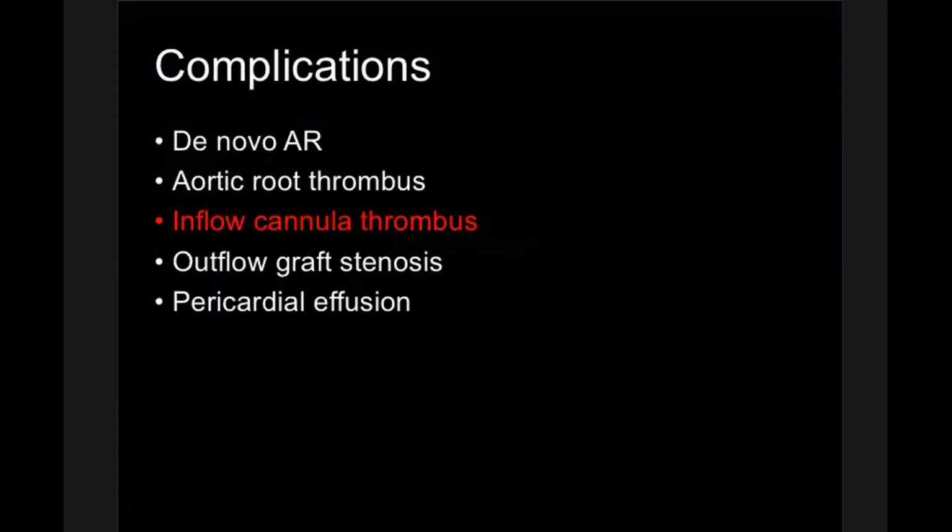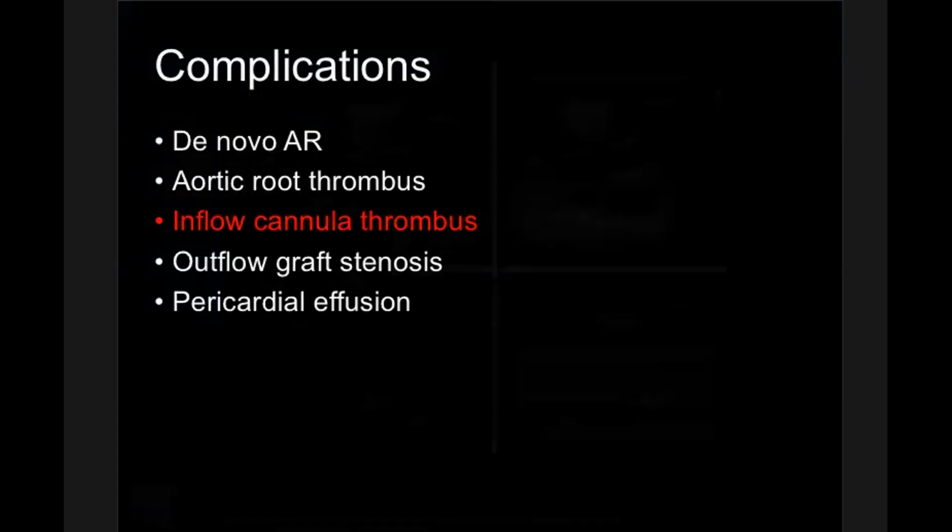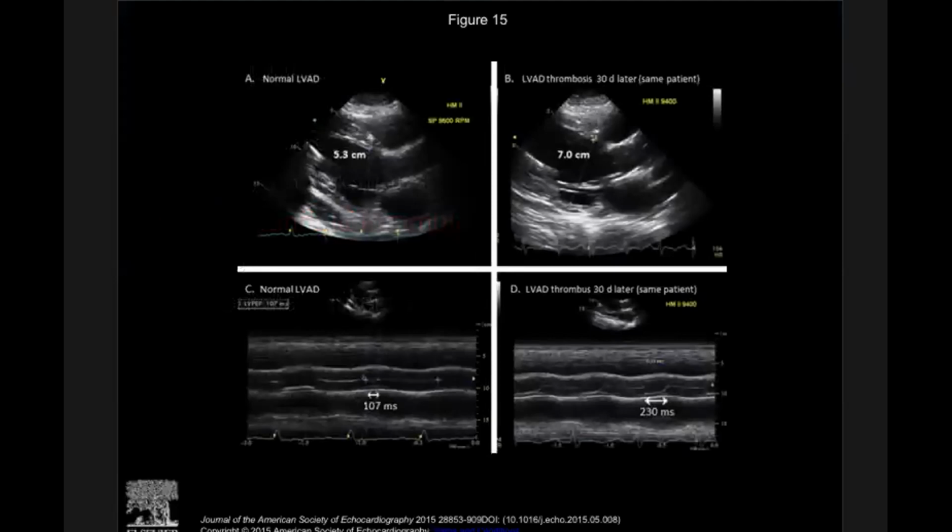Inflow cannula thrombus, I showed us this slide earlier, and that can be noted with the fact that the LV starts to dilate, and the aortic valve opening starts to increase because the inflow cannula is obstructed. So the flow now starts going out the native LVOT.